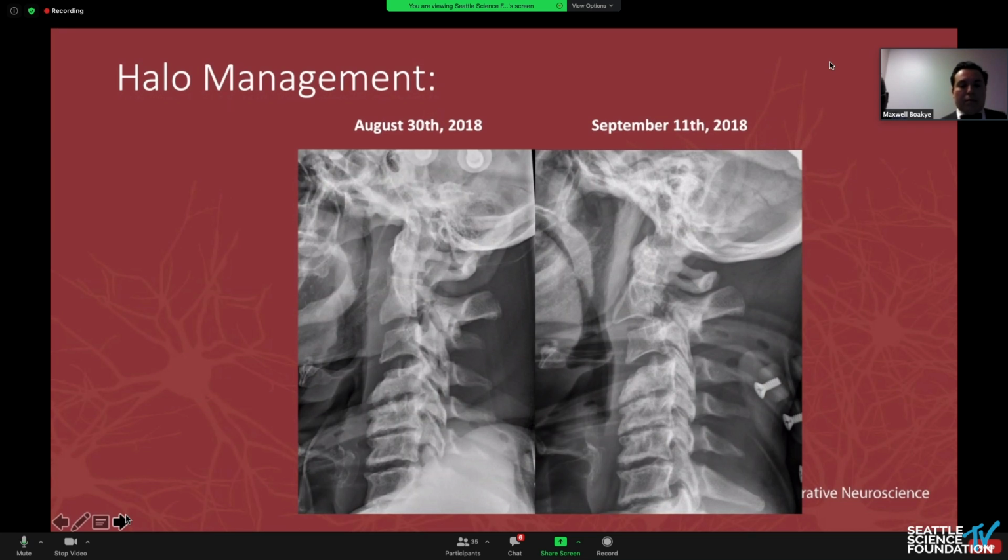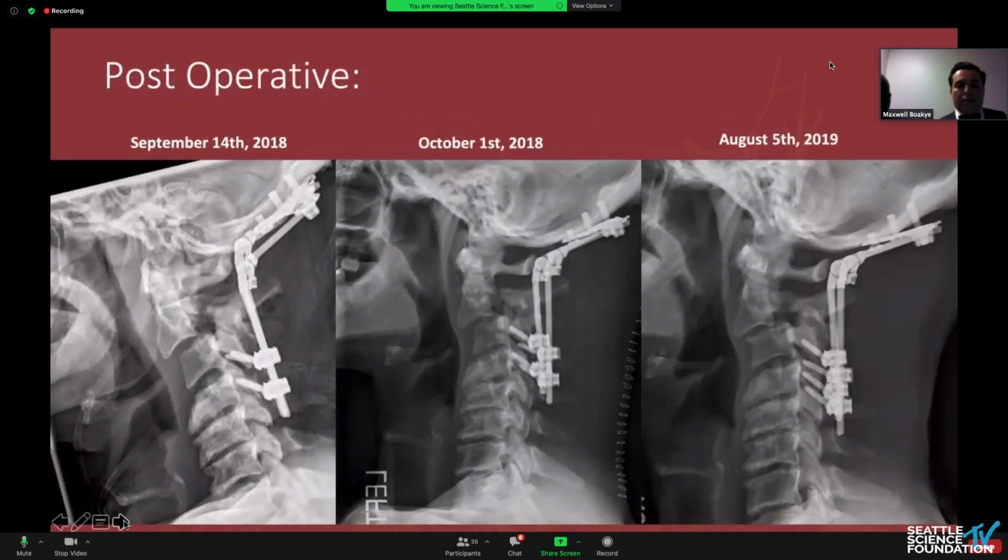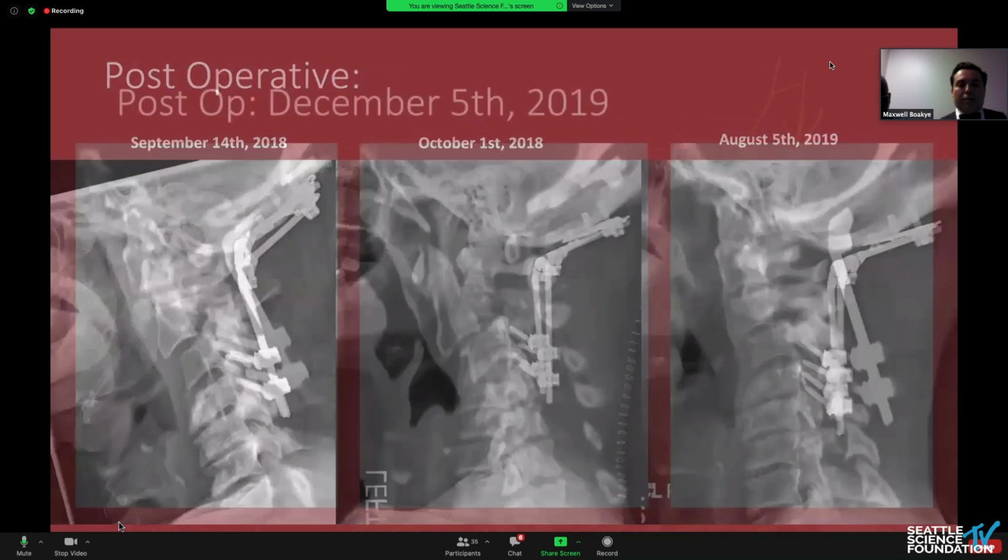And if you keep going forward, although the fracture healed, I wish we had some upright x-rays, but you can see the alignment is still pitched forward a little bit. There's still anterolisthesis. But I like going anteriorly. He's a smoker, he's young. It's kind of a big deal to go to the occiput. And to get the occiput, C1 and C2 to fuse is still, even with all the great instrumentation and BMP and everything you can throw at it, a big operation.